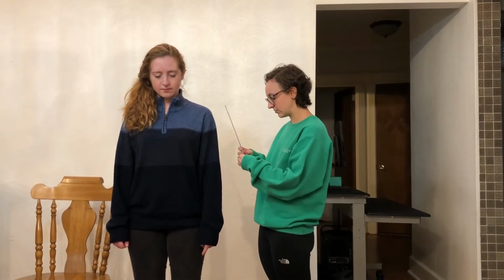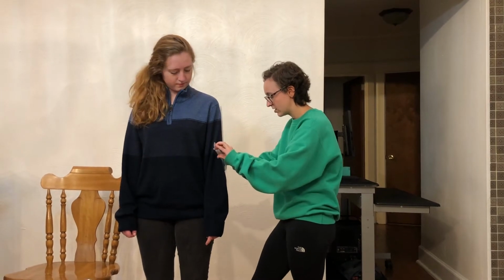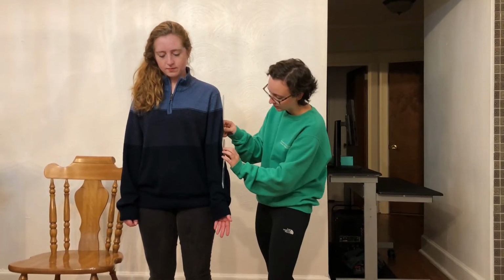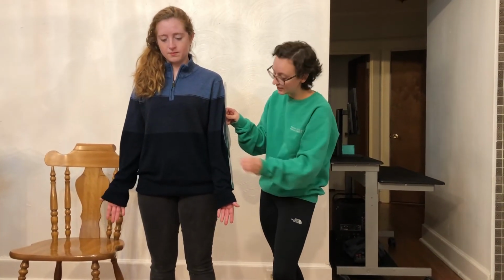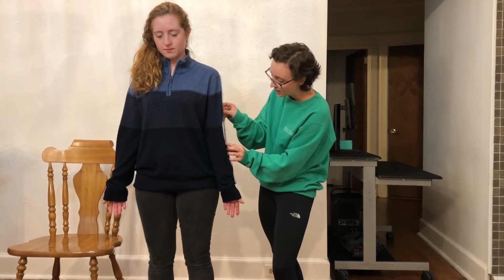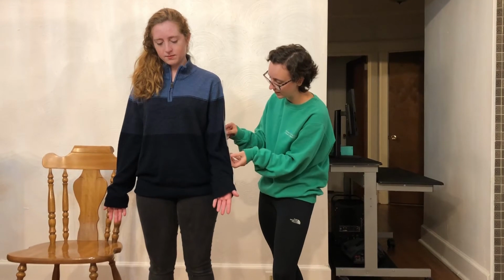So what I'm going to do is line up my axis with my patient's olecranon. Now I have my stationary arm in line with her humerus, your upper arm. We're going to start in as extended as you can. There we go. Okay, so we're at 0 for extension, which is great. And now what I want you to do is bring your hand to your mouth as far as you can, whenever you're ready.